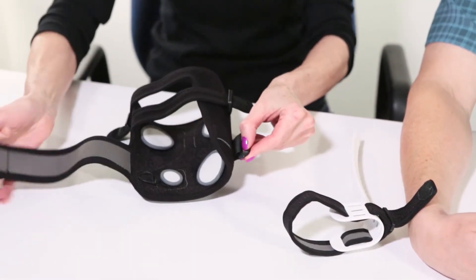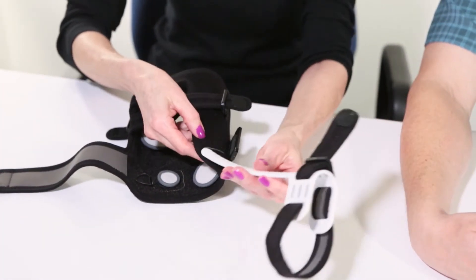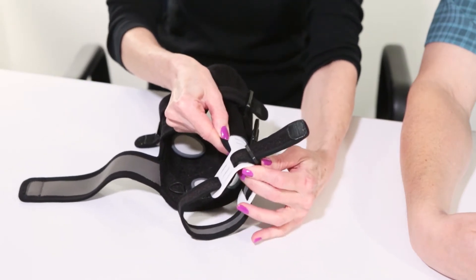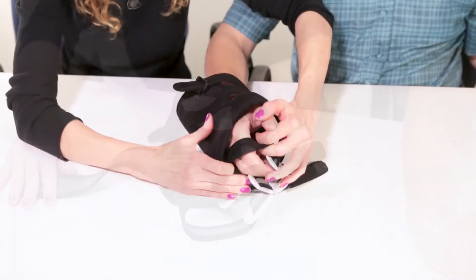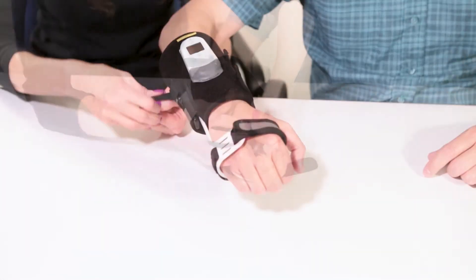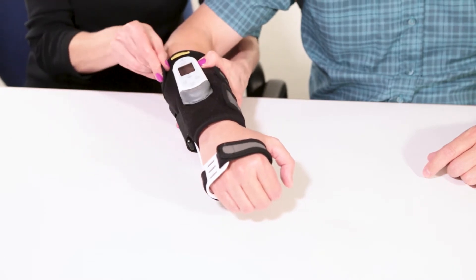To use the wrist support, loosen the strap on the wrist support, slide the base of the wrist support into the slot on the garment, slip the garment on as before, and tighten the straps including the wrist support strap.